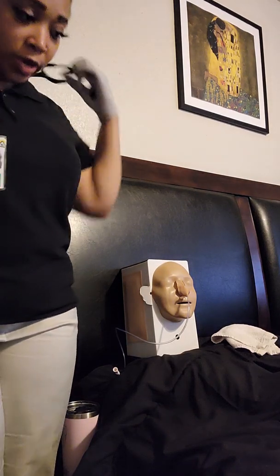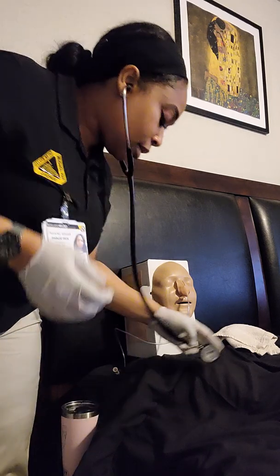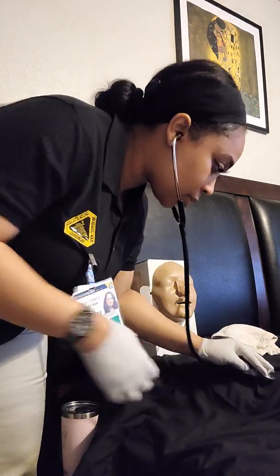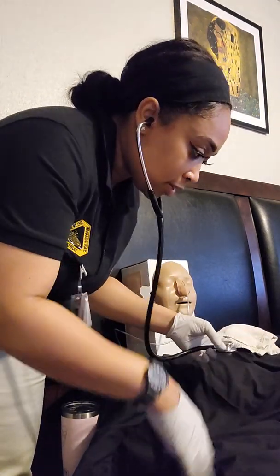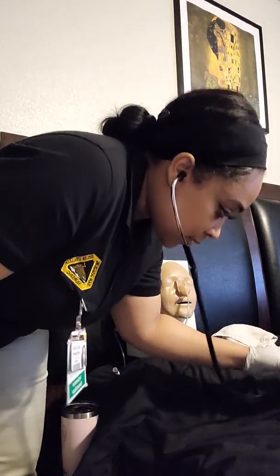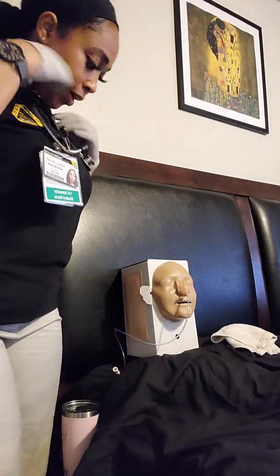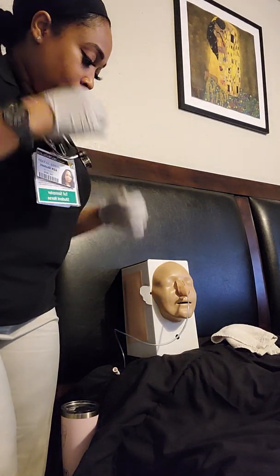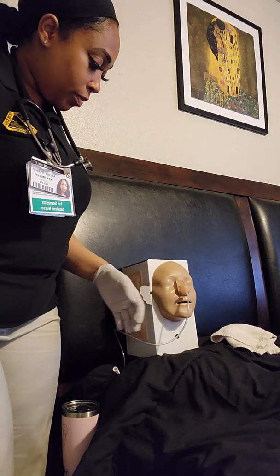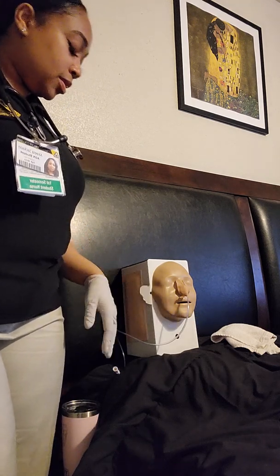All right, so I'm going to reevaluate. Listen to your lung sounds again. Perfect. I'm going to check your stomach. Looks like it went down, not as distended as it was before. And I'm listening to your sounds. All right. Do you have any questions for me? All right, so any pain, any nausea, and you feel like you're breathing just fine. Perfect. You didn't have any wheezing or crackling in your lungs either.